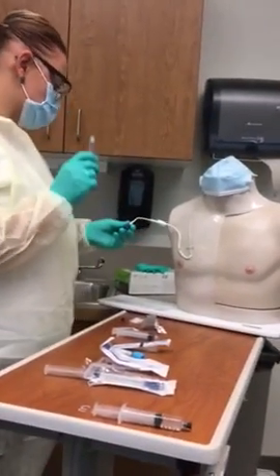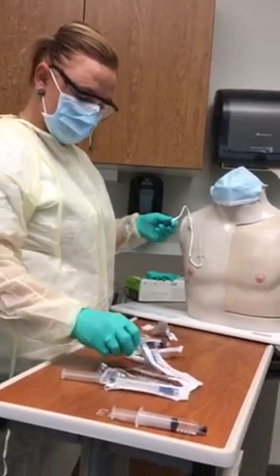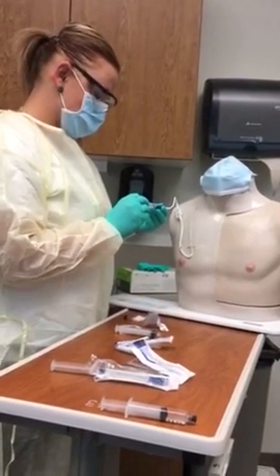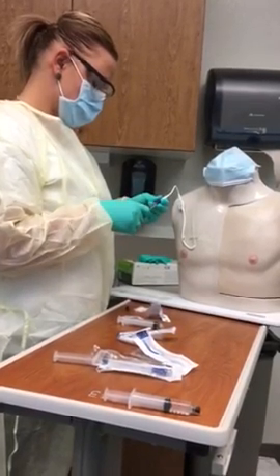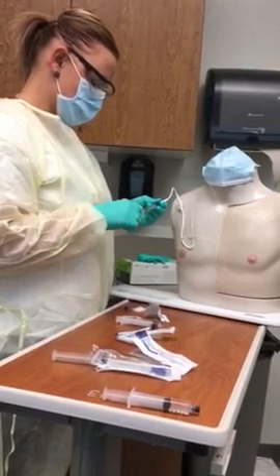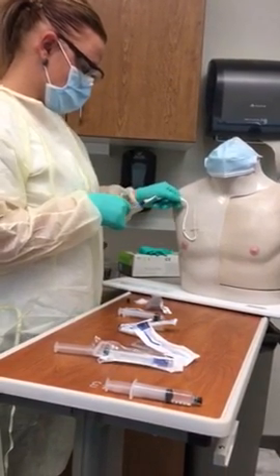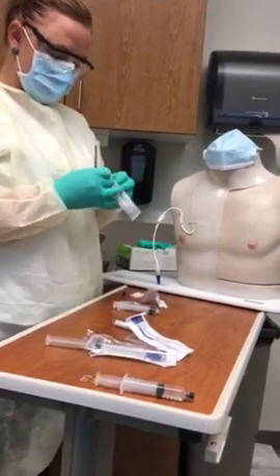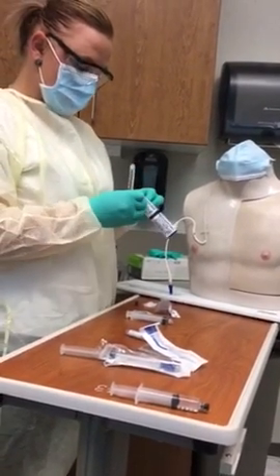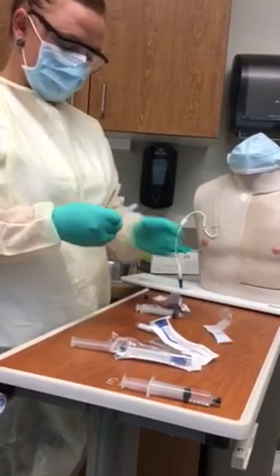Okay, so the first 5 ml we're going to throw in the sharps container. We're going to take our second syringe here. Draw the second. Our blood in this draws back beautifully. I'm going to go ahead and clamp that. And then I'm going to transfer my blood into the vacuum container. And we're going to get this sent down to lab.